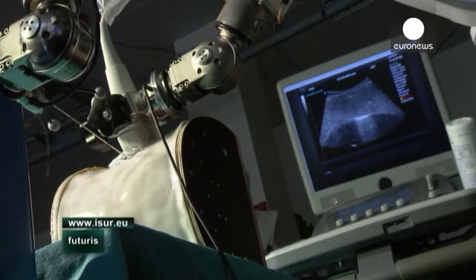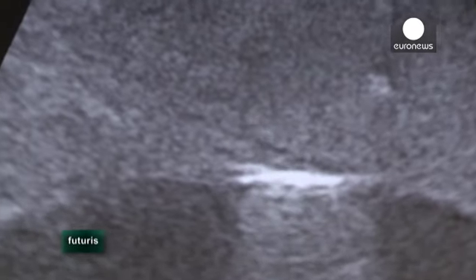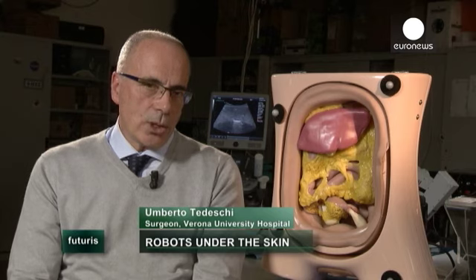And some surgeons say they are curious to see what autonomous robotic surgery systems could be capable of. We can see today how a robot is able to perform a biopsy on a tumour inside a human organ. But eventually robots could offer something more when it comes to treatment. They could even try to remove it, or give drugs, or any other substances that could help to get rid of it.